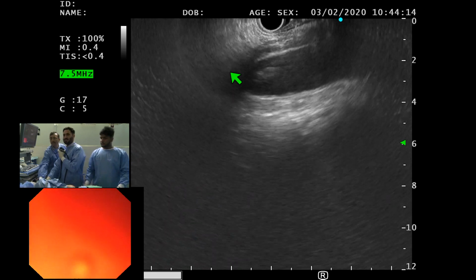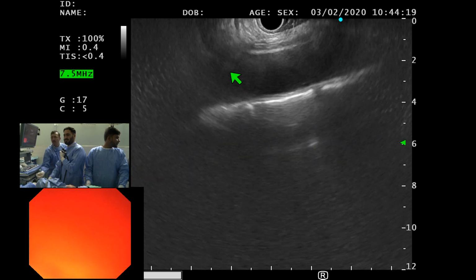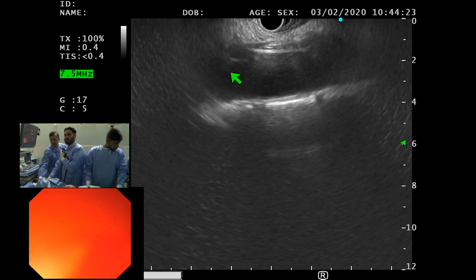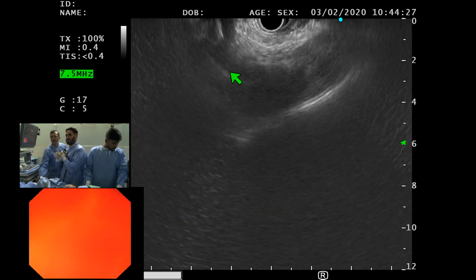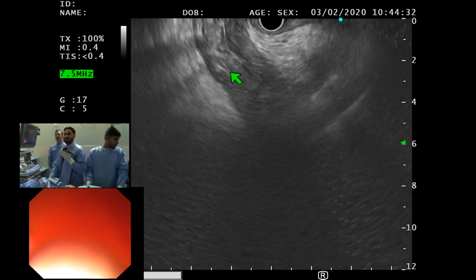No. Look, you have to push, we have to slide along. I'm trying to push and you're trying to pull me. Okay, if it is getting stuck at the hiatus, then go ahead, there you go.